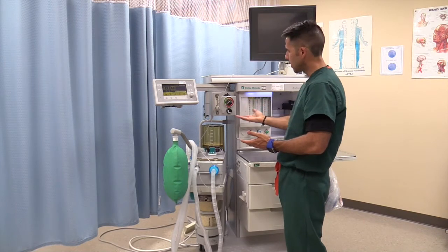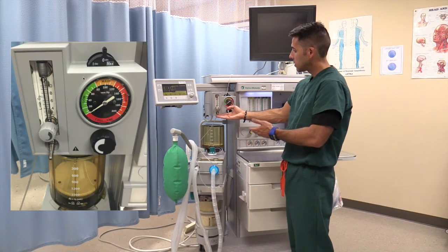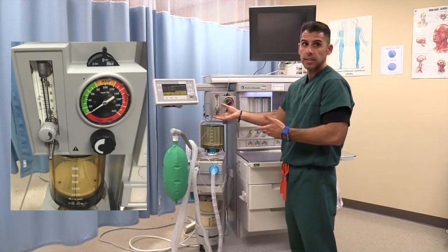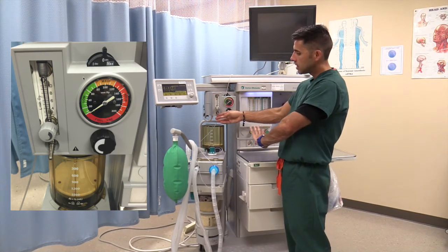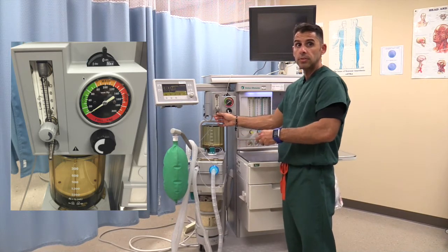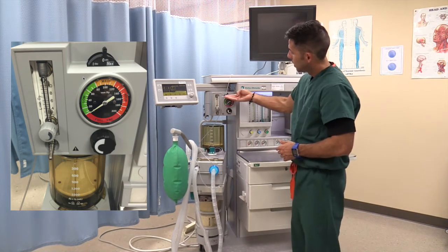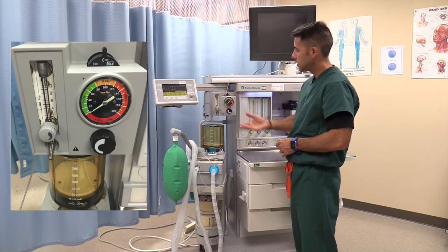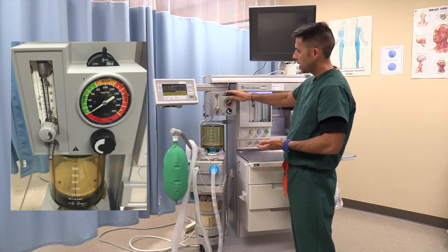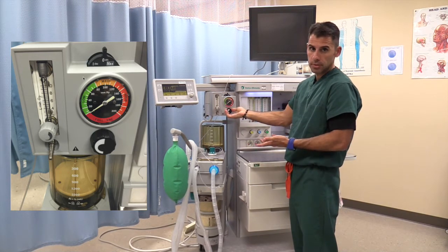Moving on, you will see what looks like an oxygen gauge. This is an ancillary oxygen gauge, and its importance is that it is independent from your ventilator. If you have a failure in your ventilator and need to hook up your AMBU bag, you can do so through this gauge. Right next to this oxygen gauge, we have the suction gauge. You can see how much suction you have on the patient and adjust it through the knob.